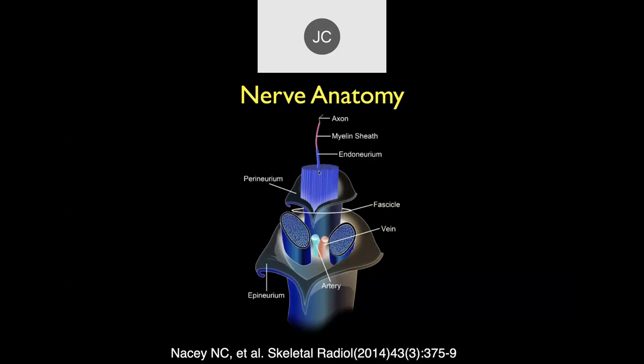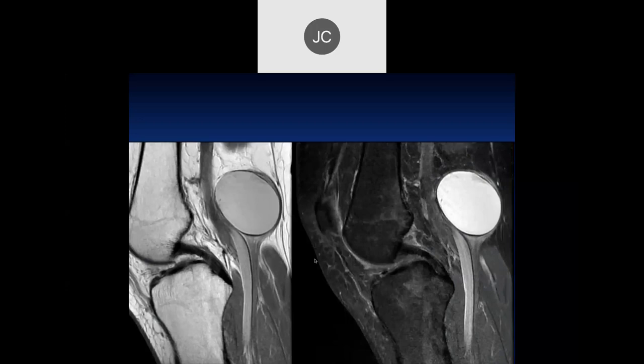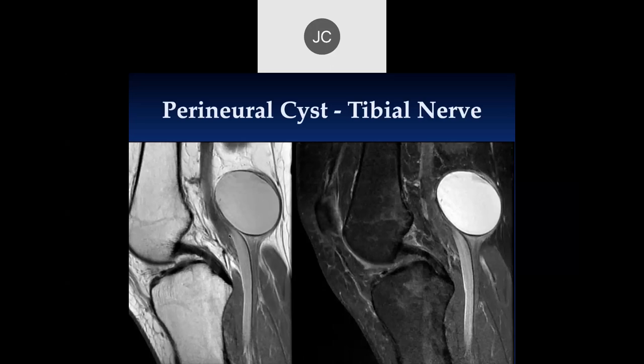So, Elio, are you next? This looks like an eyeball stuck in the calf. It seems to be associated with the splitting of that nerve. It looks like a nerve coming in here with a nerve sheath, and here we can see the popliteal vessels. And here's the nerve, which is markedly thickened, and then we have this big thing in it. This was a perineural cyst involving the nerve.